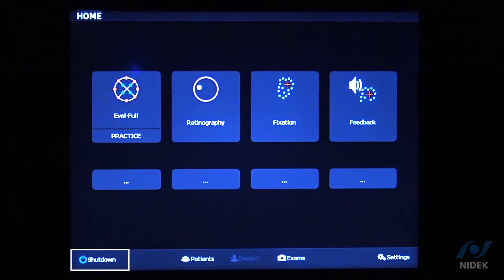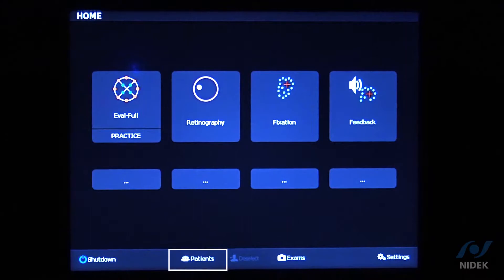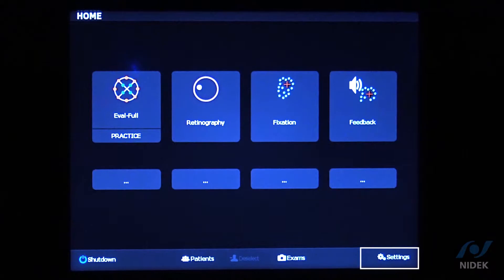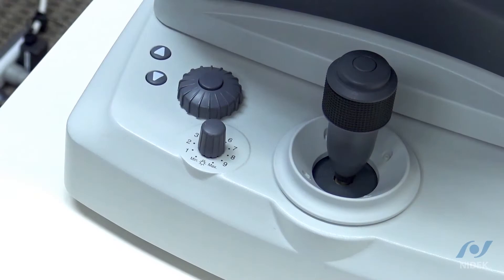Down here on the bottom left-hand corner is the shutdown, which will shut down the operating system on the microperimeter. We also have the Patients tab where you can select patients or enter a new patient, the Exams tab where you can look at the patient's exams, and then the Settings tab where you'll change the settings for each one of these functions.